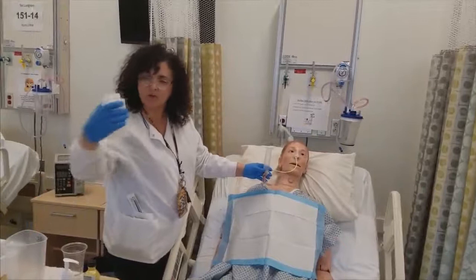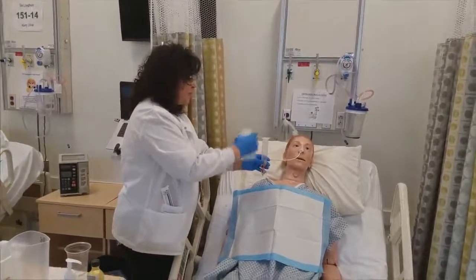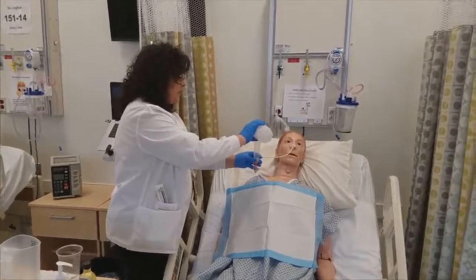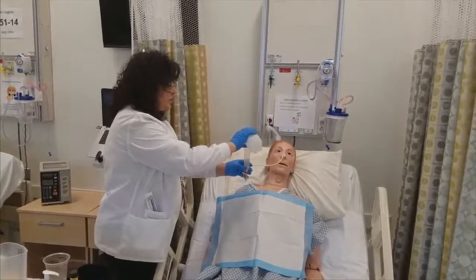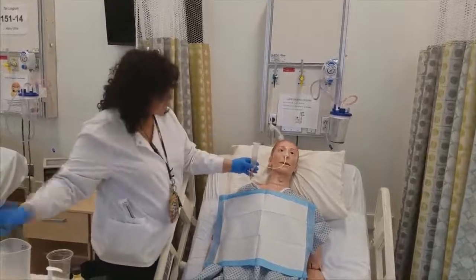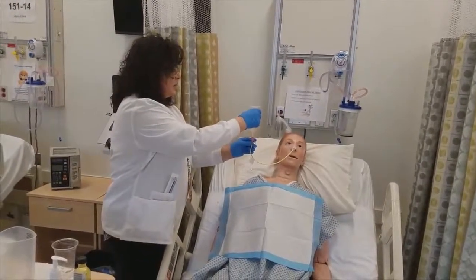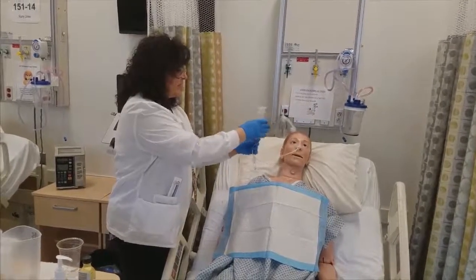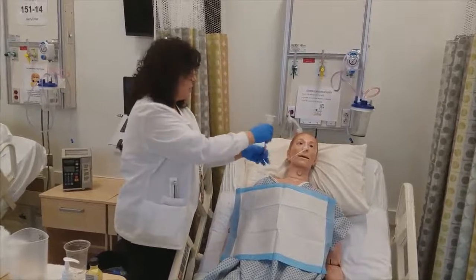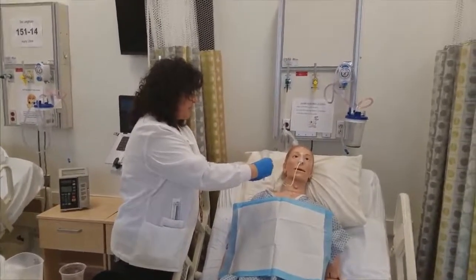I'm starting out with 250 milliliters of water, but my flush here is only 30 milliliters, and I'll use the markings right on the syringe to measure. And I'll let that run through. And now I know that my placement is unchanged, my GRV is good to go. So I'm going to go ahead now and prep my meds.